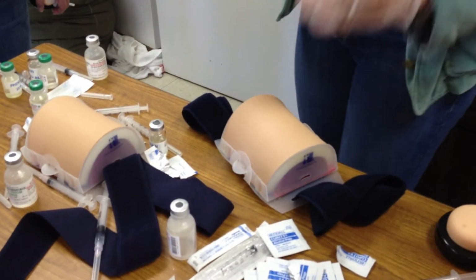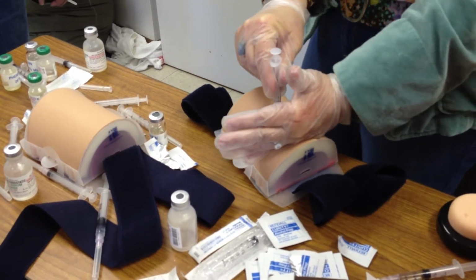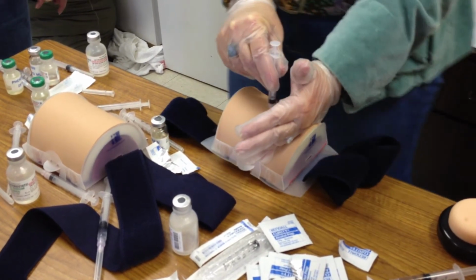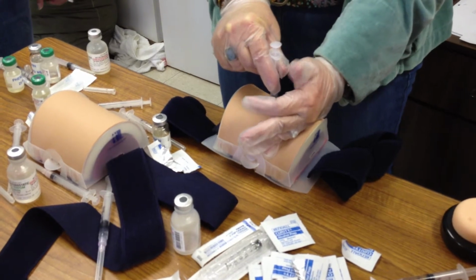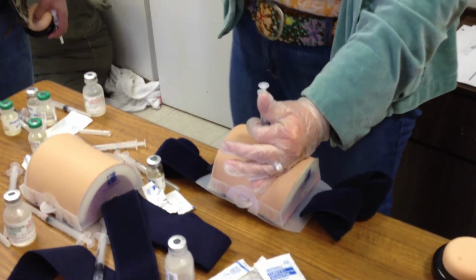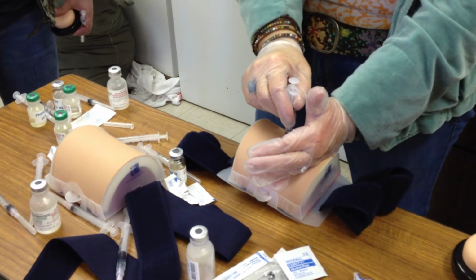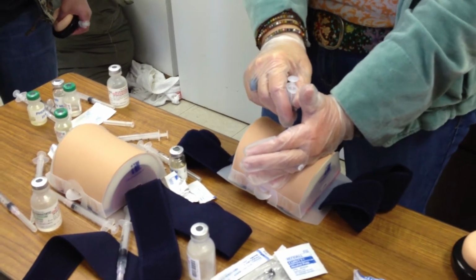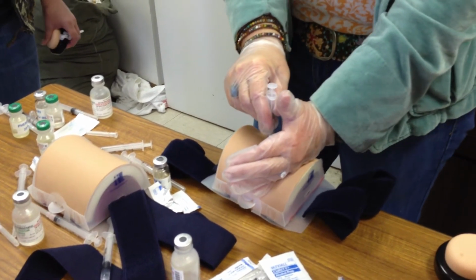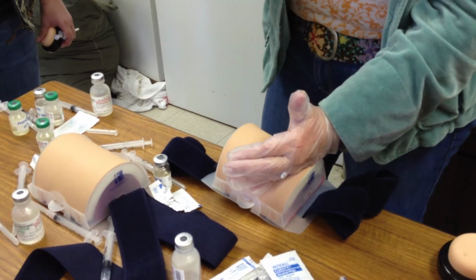The book says when you're in this position, though, after you've aspirated and you're in the patient, to wait 10 seconds. Now, the reason they say that is you're trying to give that medicine time to displace in the tissues so that you're not pulling out so fast that the pressure's going to force it back out. So I usually stand there for a second or two, and say, okay, Mr. Jones, just about done. Everything's fine. And say a few words to the patient, and then I come on out with my needle.